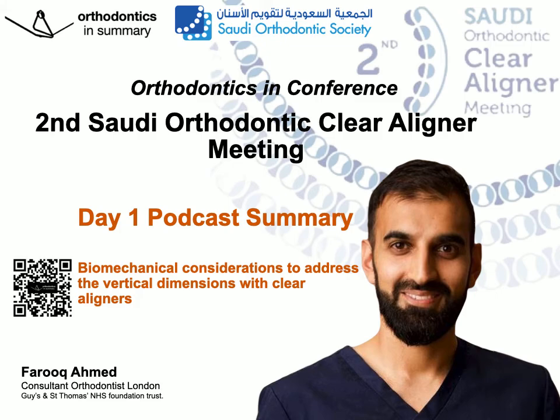He described a great case, class 3 case with anterior open bite. For this, he used TADs as well as aligners. So he placed TADs in the retromolar region. He had the patient wearing elastics from the lower canine region to the retromolar TAD, and also had the patient wearing class 3 elastics as well to the upper aligner. And he showed a fantastic outcome where the patient had a class 1 finish at the end.